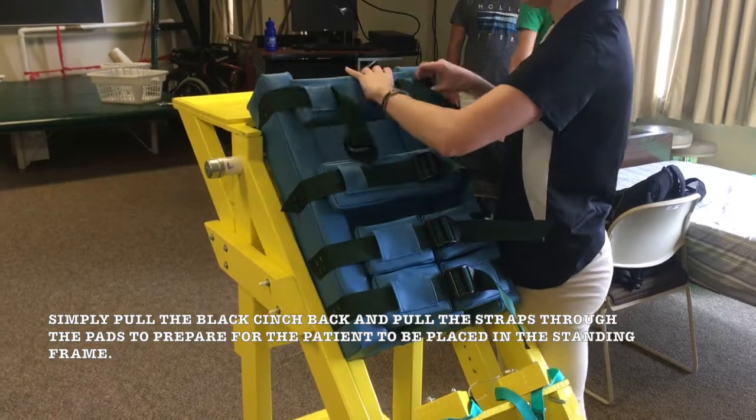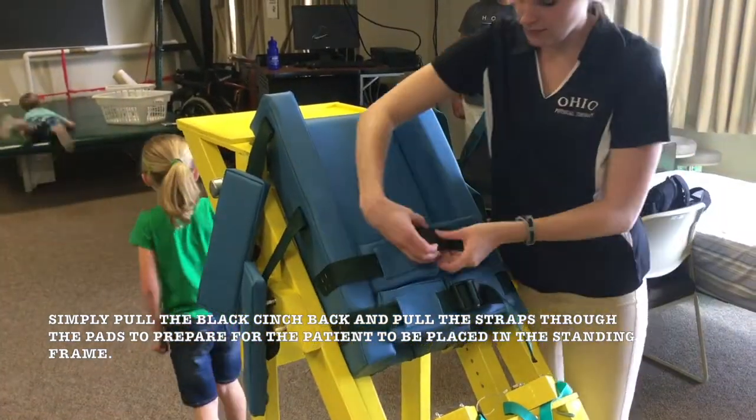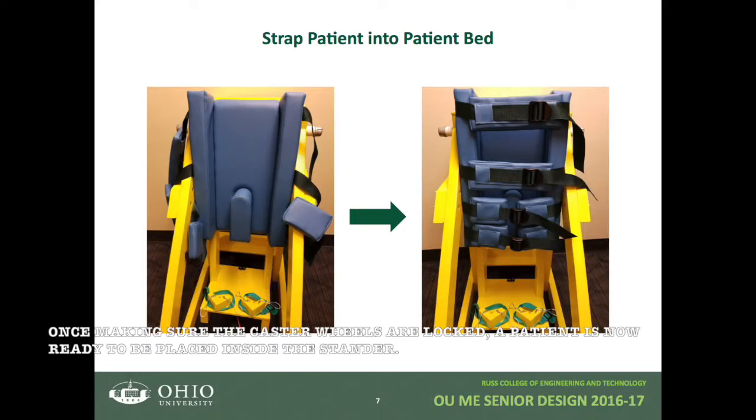Next, open the straps for the patient support bed. To undo the straps, simply pull the black cinch strap back and pull the straps through the pads to prepare for the patient to be placed in the standing frame. Once making sure that the caster wheels are locked, the patient is now ready to be placed inside the stander.